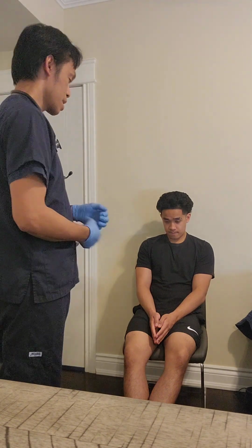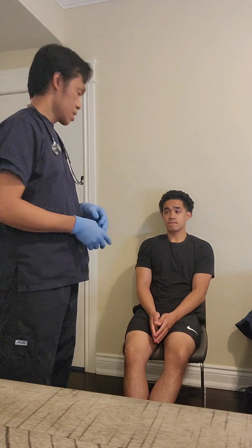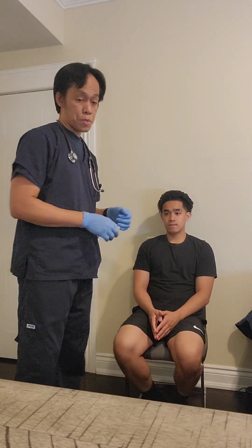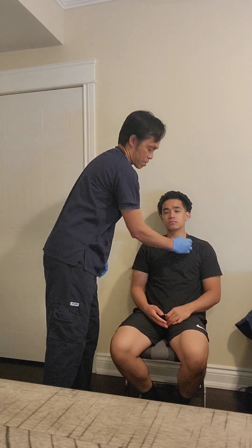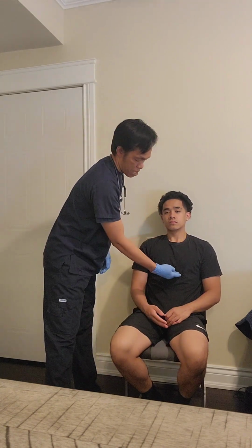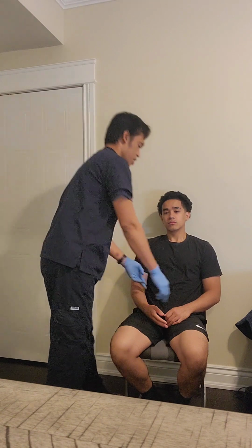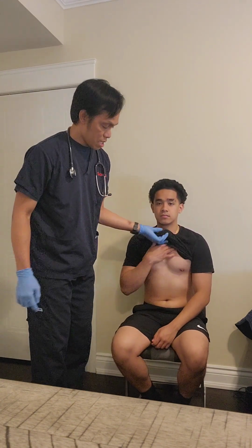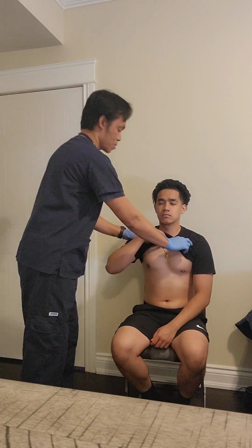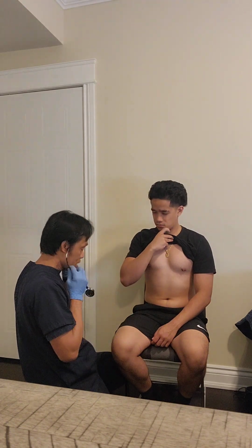Now I'm going to assess the apical heart rate, which is a test for the mitral valve, and it is situated on the mid-clavicular line and on the fifth intercostal space on the left, which is basically below the nipple line. So I need to expose your chest. Kindly hold it for me. So now I'm going to auscultate the mitral valve.